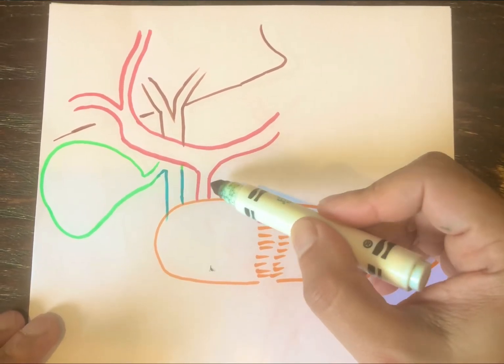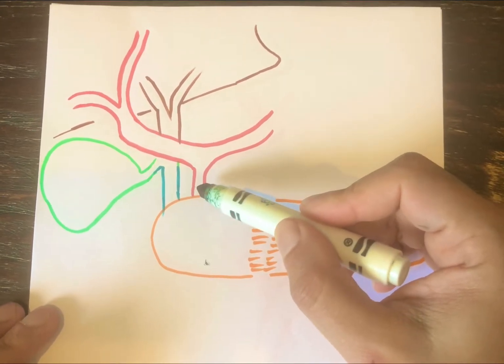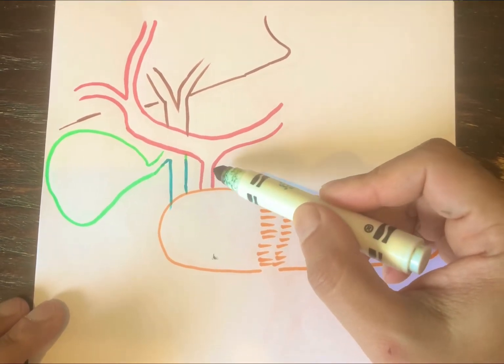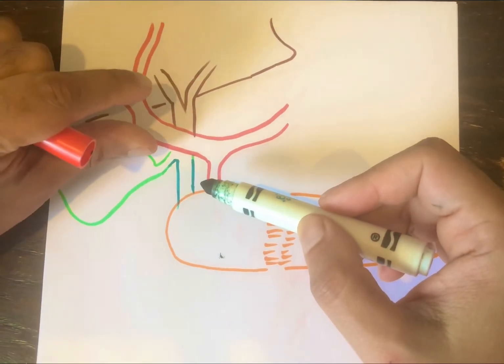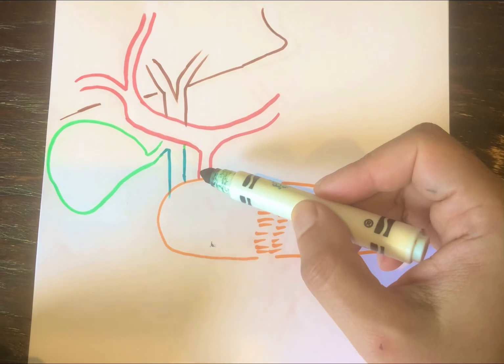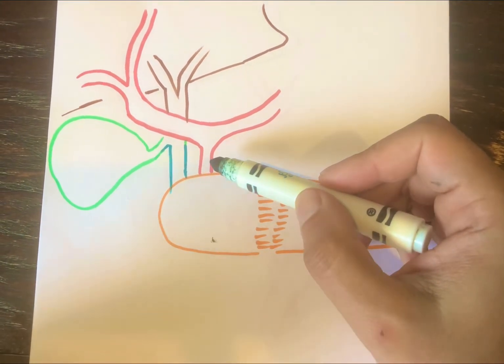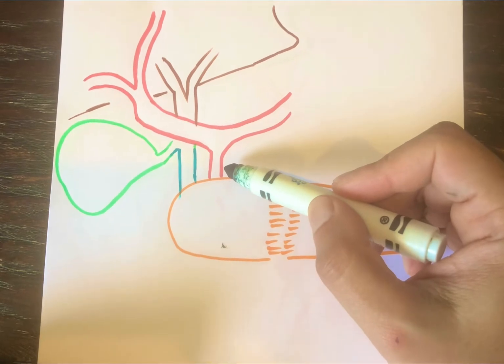So this artery has to go. What you do is you dissect around the artery, get a vessel loop around it, then put a vascular clamp and then you put your other hand in the hilum and you feel for a pulse, or you put a Doppler and you're going to hear an arterial signal. Then once you've confirmed that this is a gastroduodenal artery, then you tie it.